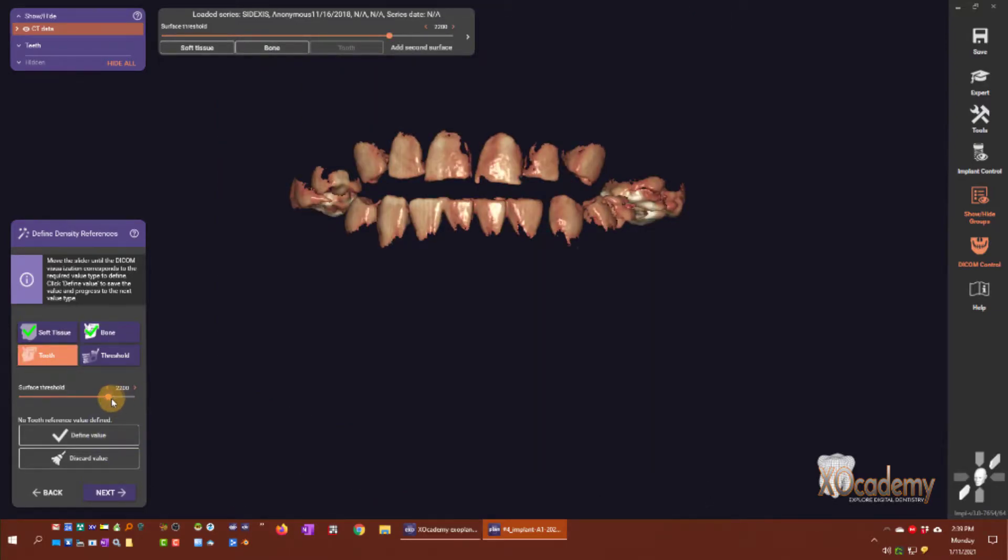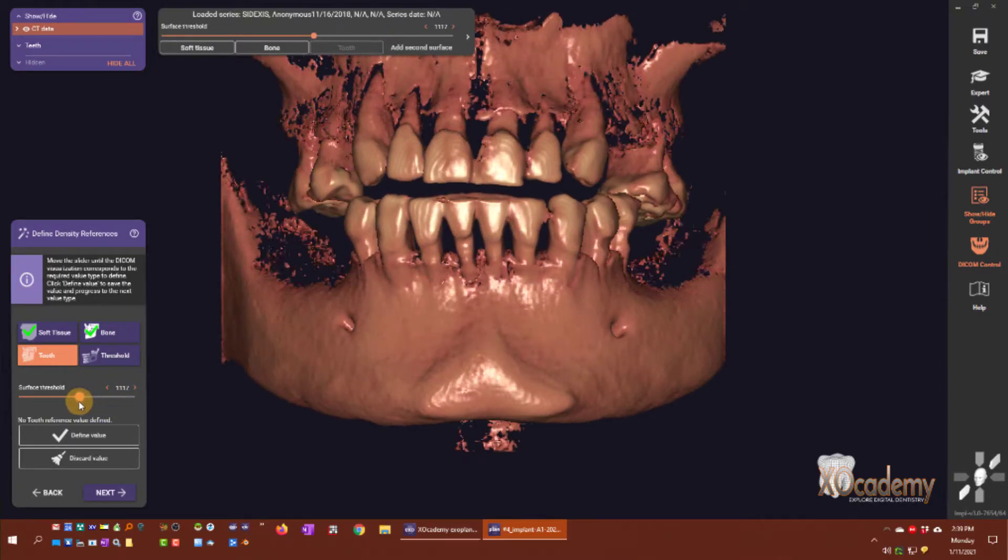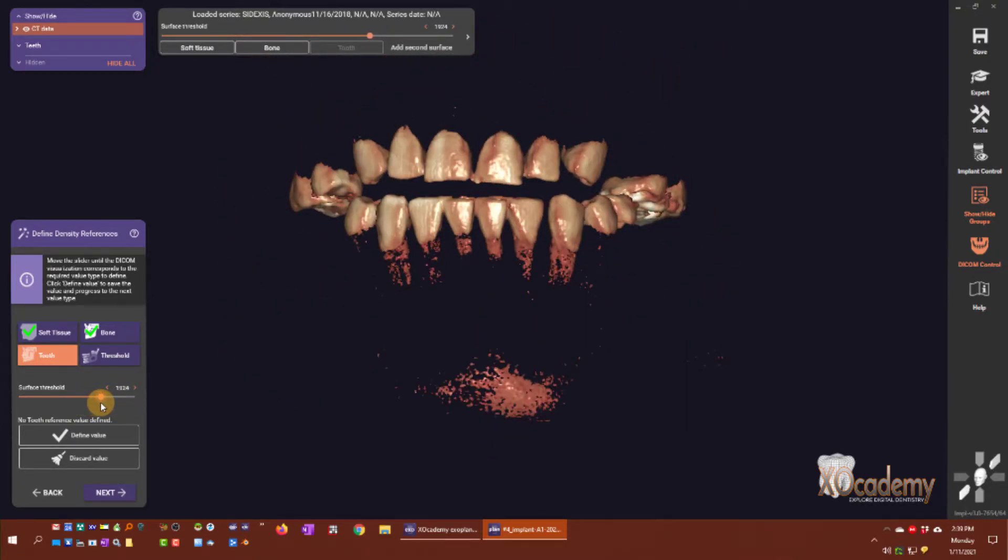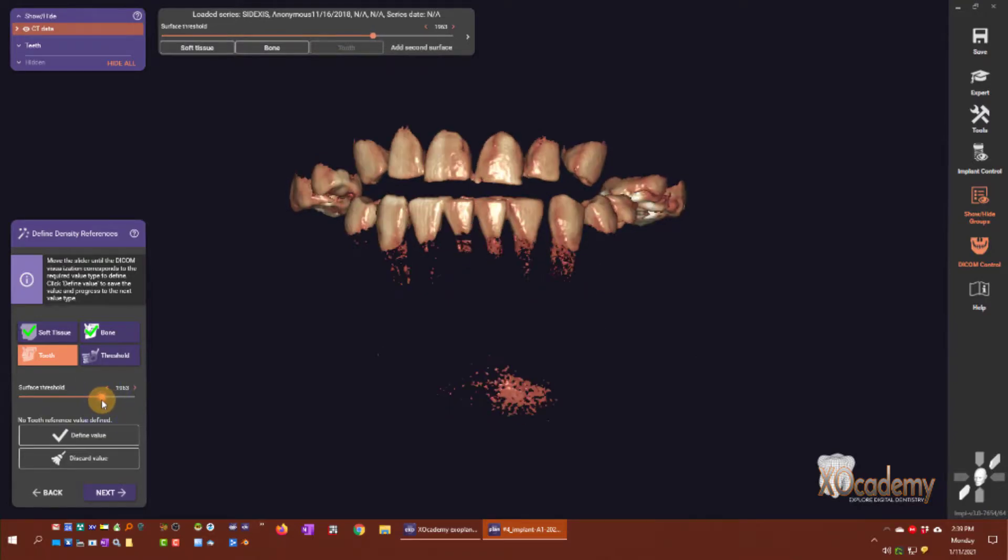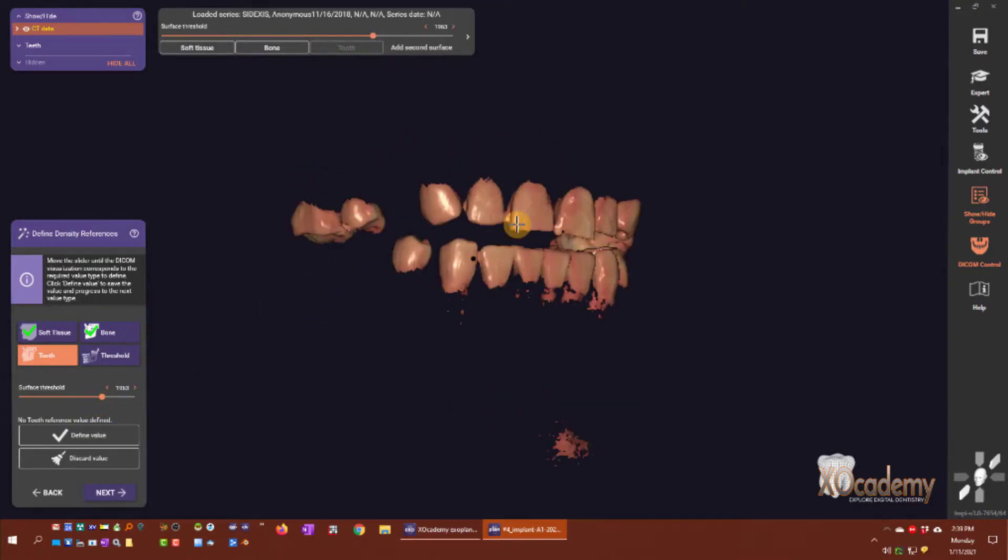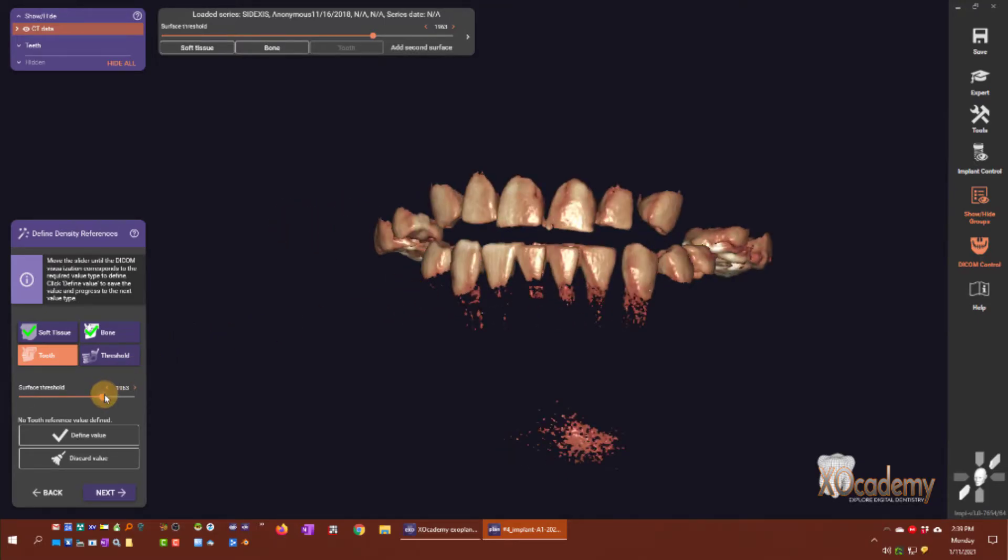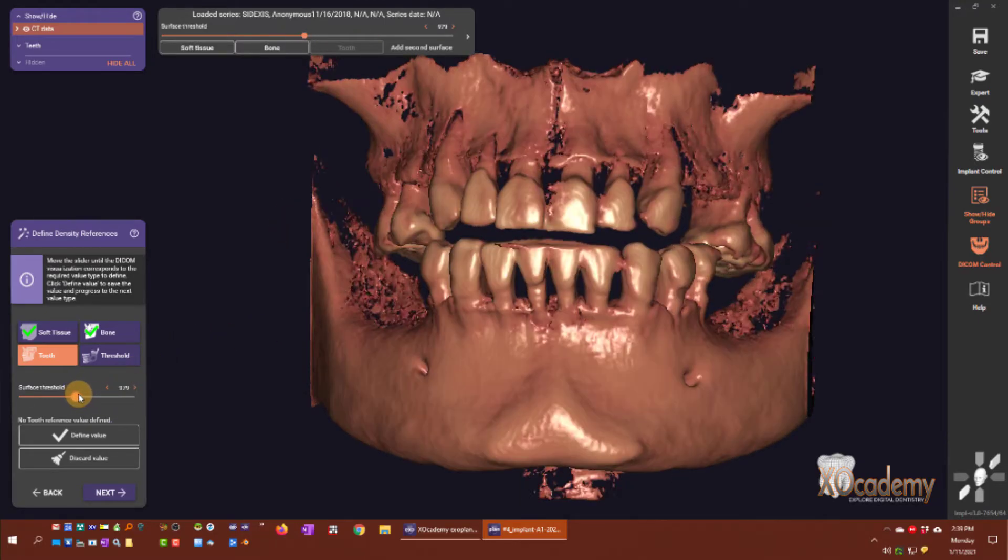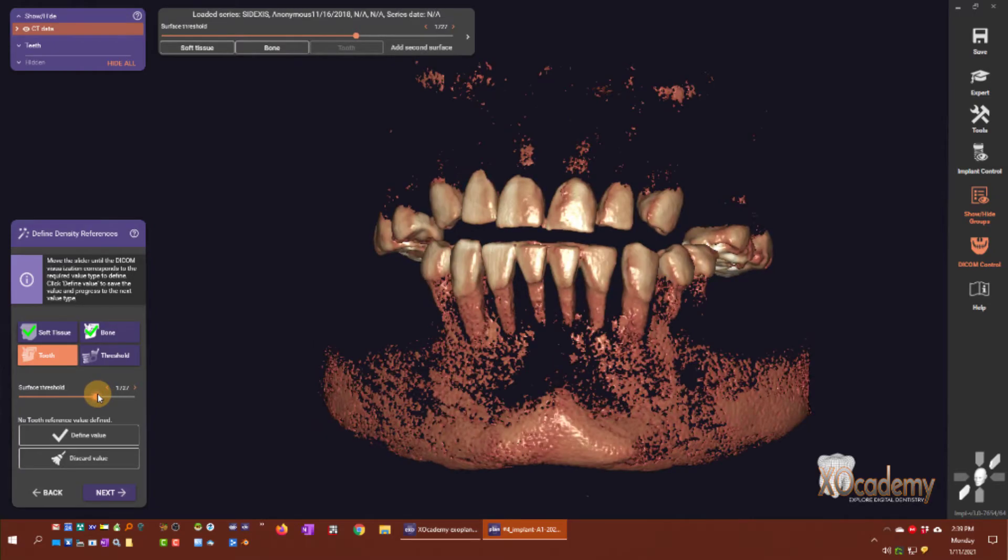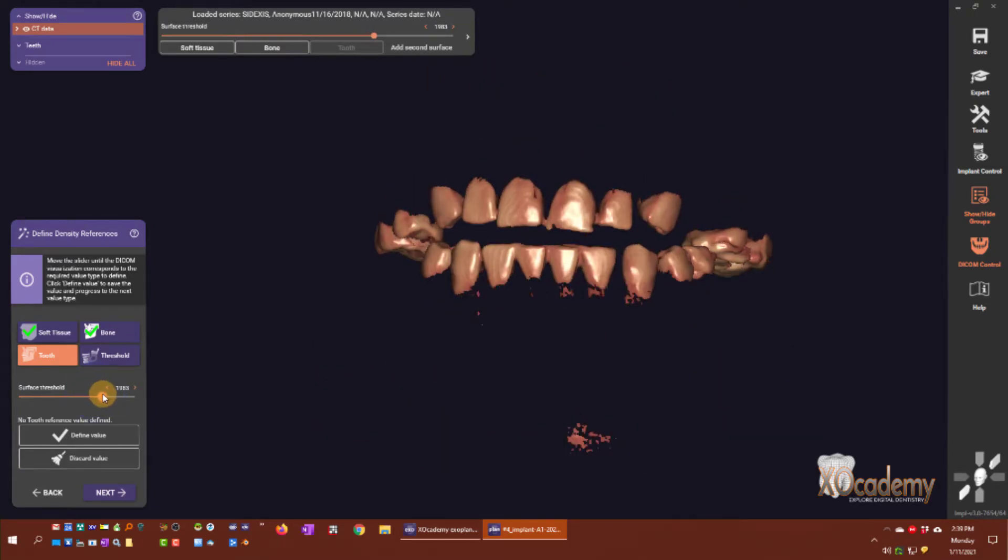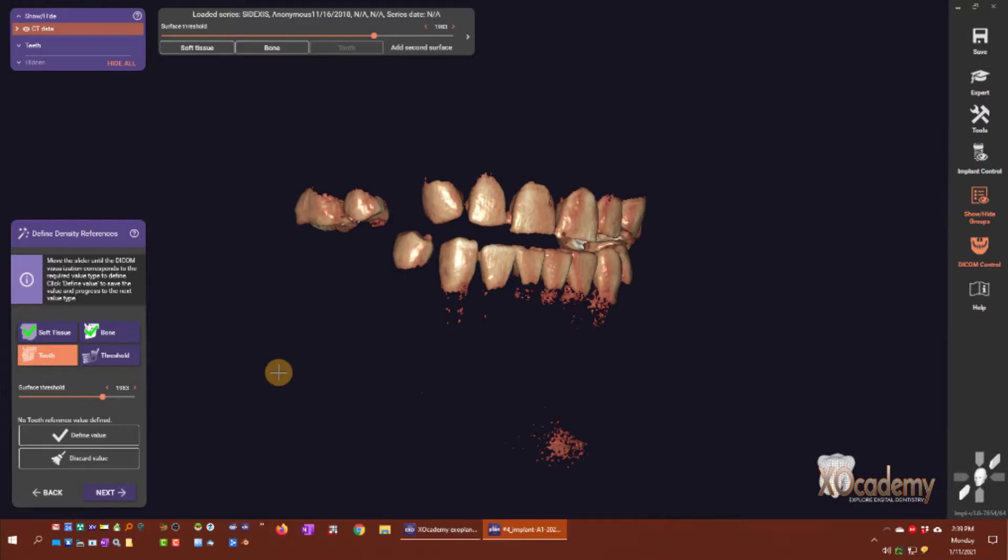Now we have tooth threshold. This is where I'm going to just show the enamel. Exoplan is going to take a guess at what we want to start out with. I'm going to go right to where we just show enamel and click define value.